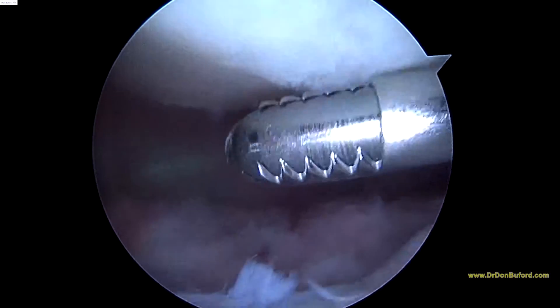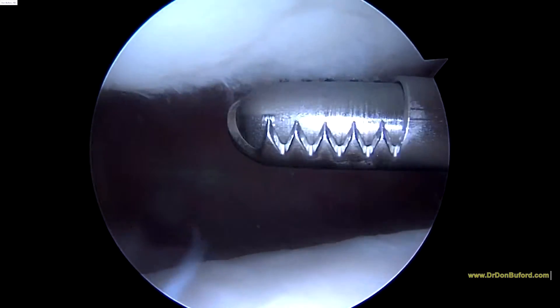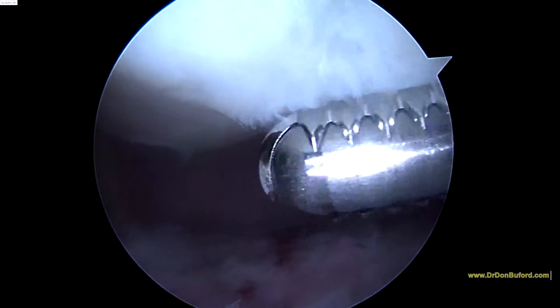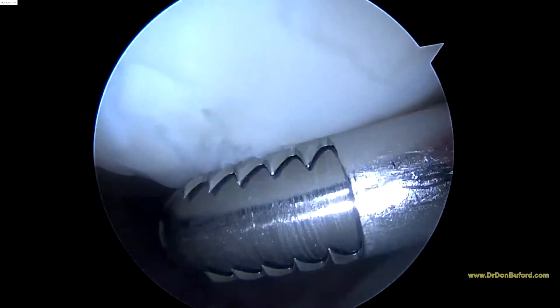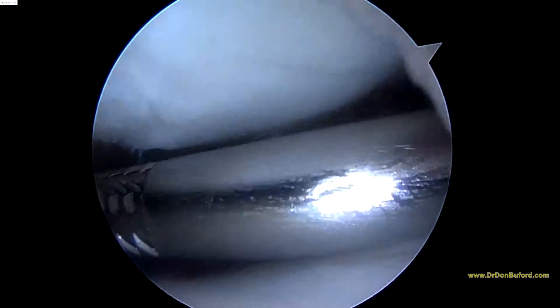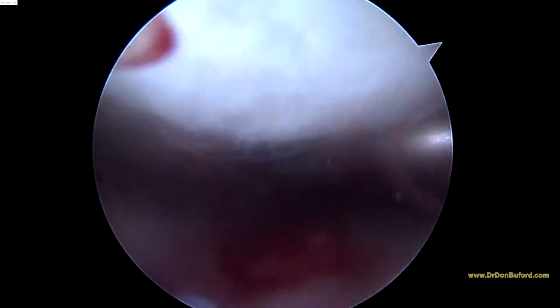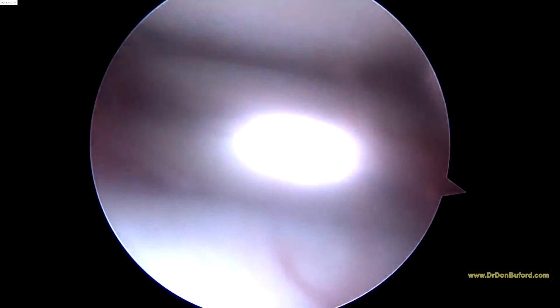You can see how these areas can cause symptoms when they flap down and get caught. I think we've smoothed out all the areas that need it. The cartilage is intact — it's just these areas that are starting to break down, and they're way too young for this to start happening. So we want to try and arrest that process with the stem cell injection, and that's what we're going to do next. The arthroscopic portion of the surgery I think we'll finish up right about now. I don't see any other problems in the trochlea — the trochlea is this groove that the patella glides in.